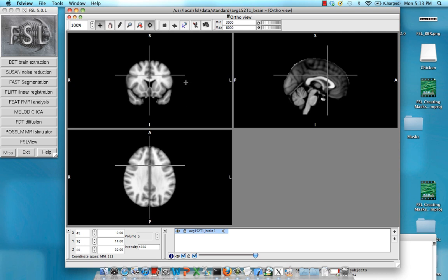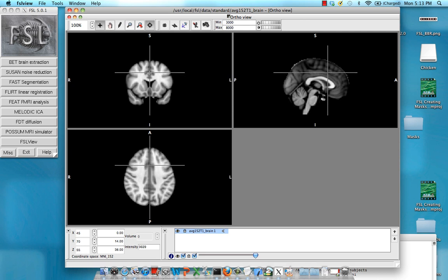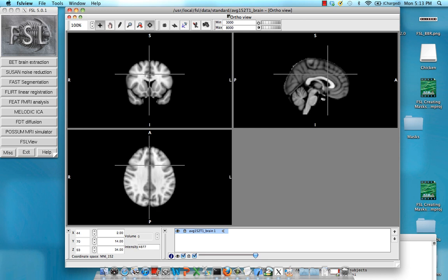Let's say we want to create a mask based on, just like Microsoft Paint. We fill in places that we want for our region of interest and make that 1 and 0 otherwise, so that when we run the region of interest, we only extract data from those voxels which have been painted on.